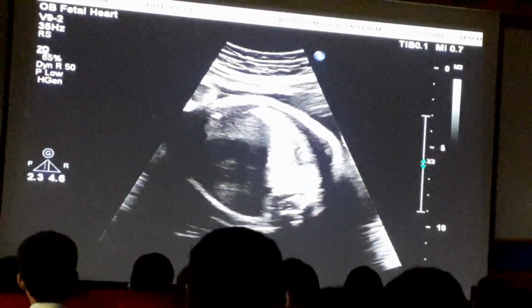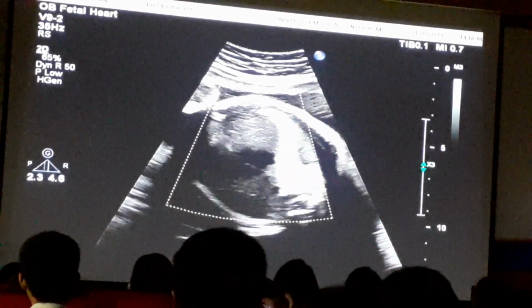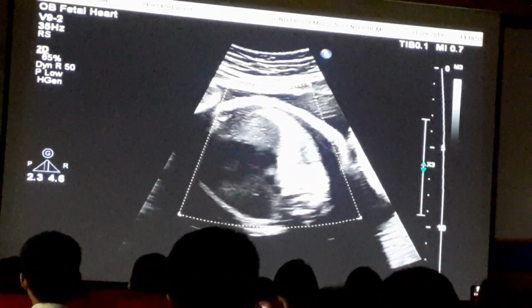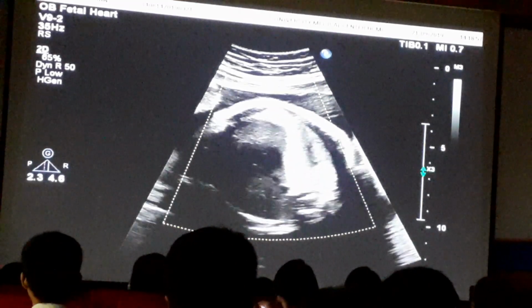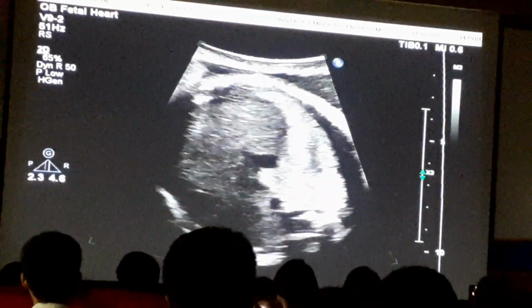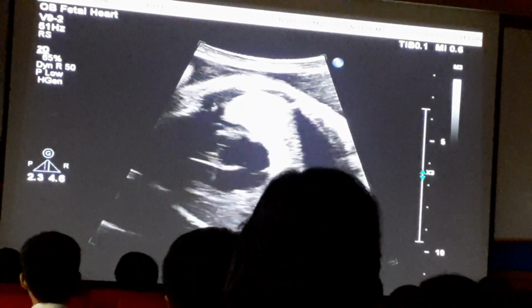Mình thấy là phổi Doppler trong động mạch phổi phải có vẻ như kháng lực thấp, bởi vì Doppler không giống như bình thường mà cô chỉ cho mình thấy, thì có thể là do nhu mô phổi có vấn đề và làm kháng lực giảm sút. There's the macrocystic, microcystic, and mixed types.